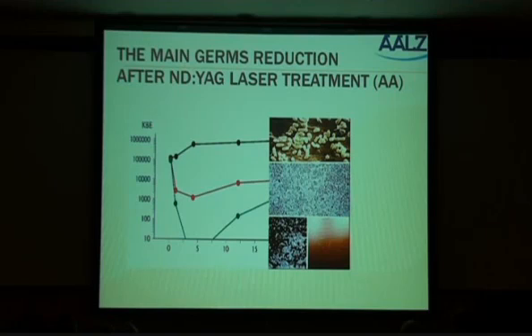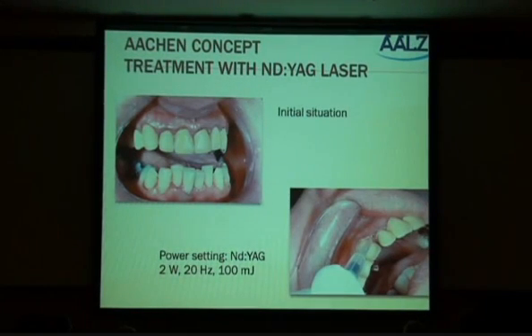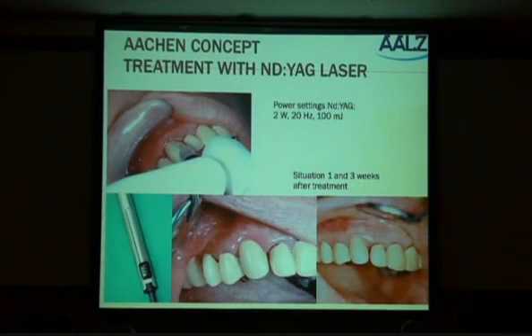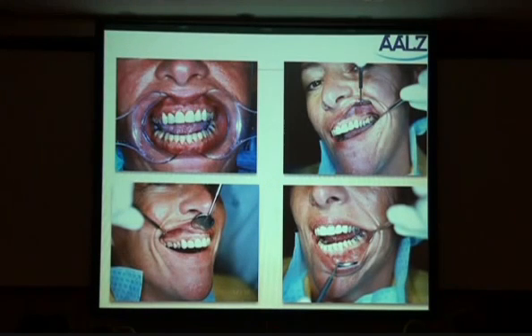So we can see using additional laser to the conventional treatment will give us a much higher treatment success, and I think that is not only good for you, but it's especially good for our patients. And of course, we are combining the conventional treatment, and then we have special settings to use the laser in the outside, to go into the periodontal pockets, and already after 1 week and 3 weeks you can see a huge and nice improvement. What is also seen in these situations in a very nice follow-up, how the periodontal tissues are healing and how good the reaction is, and patients, they will just follow and see themselves. Also the bleeding on probing, the pocket depth, very good progress. I don't place now all the factors because of our time limitation.